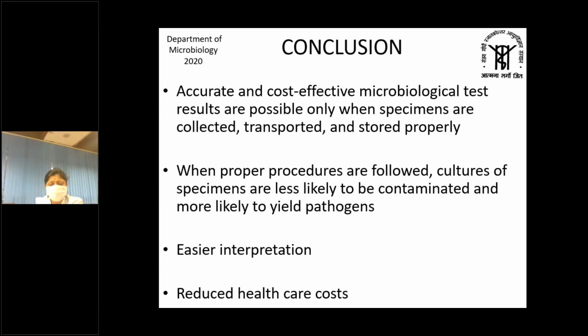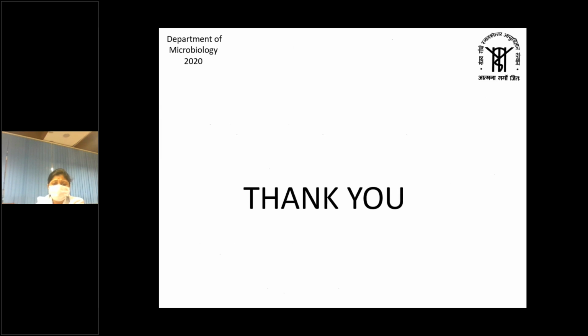So the conclusion is, accurate and cost-effective microbiological test results are possible only when specimens are collected, transported, and stored properly. When proper procedures are followed, cultures of specimens are less likely to be contaminated and more likely to yield pathogens.